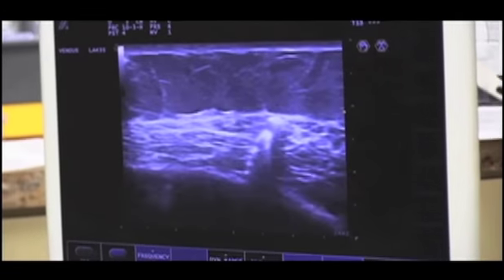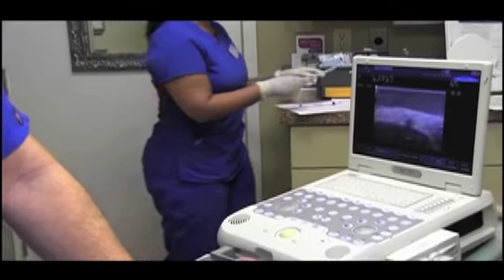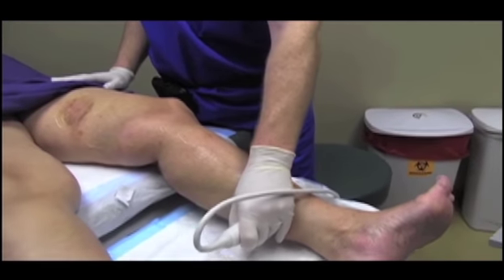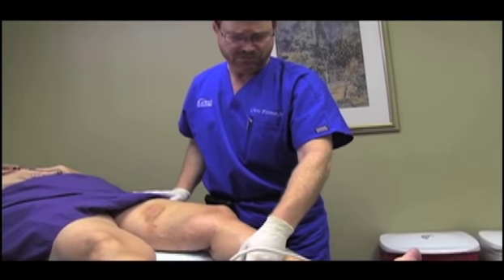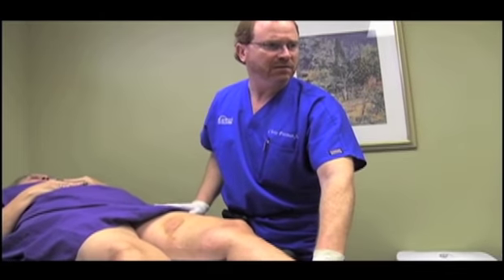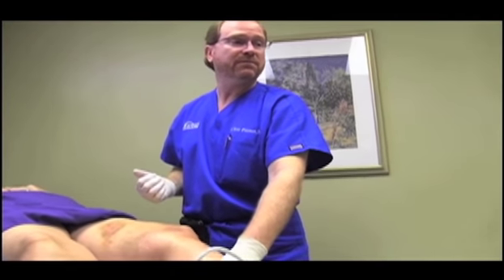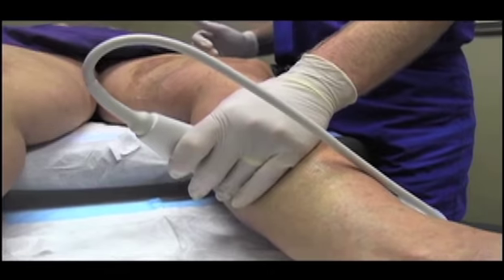What we're going to do now is have Miss March just lay back for five minutes and let that foam dissipate. We don't want her to get up or move around just yet — let that foam sit in there and do its job. I'm just pushing this foam into all the little nooks and crannies of her bad veins. Then we're going to put her in compression hose for about a week, because now that we've irritated the lining of the vein, we want it to heal shut.